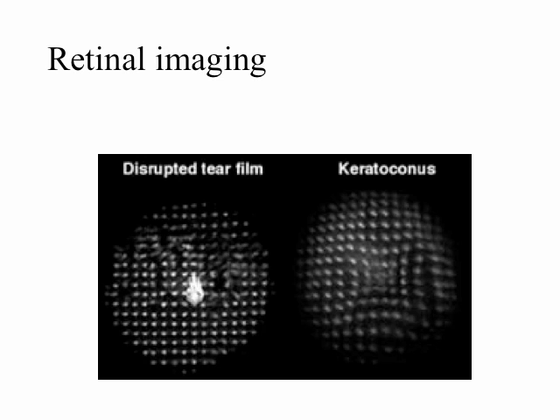We know a trick question we always ask: what's the most important optical element in the eye? Well, if you want to be a smartass, it's the tear film, it's not the cornea. But you can see in this slide that disruptions in the tear film will greatly aberrate, if that's a word, the wavefront on the left. More interesting is the slide on the right, where you see centrally the little dots are very, very closely packed, indicating that there's a part of this wavefront that is very myopic, and around that, the little dots are much more spread out, and this is a part that is relatively hyperopic.